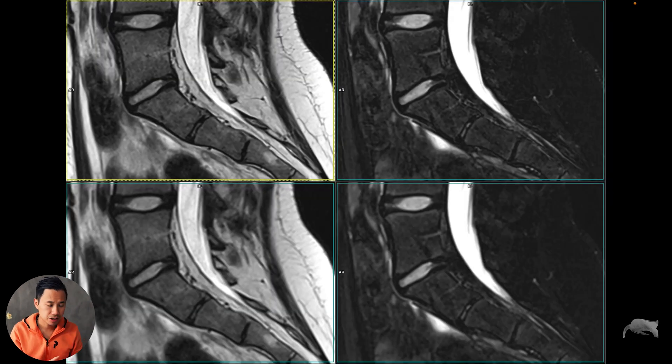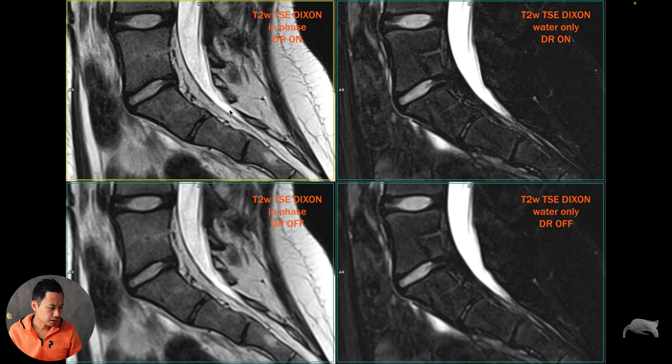Let me show you some images. In the upper row, Deep Resolve is on; lower row is off. This is the in-phase — the water-only is the same below. Looking at the in-phase with Deep Resolve off, you can see the small structures get a little blurry — that blurriness is what I was used to without Deep Resolve. But with Deep Resolve on, it's much sharper — it's a win situation.